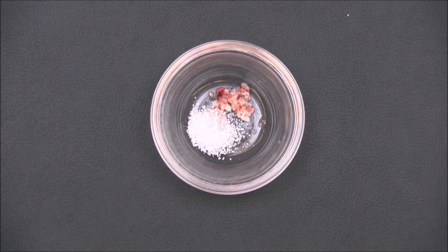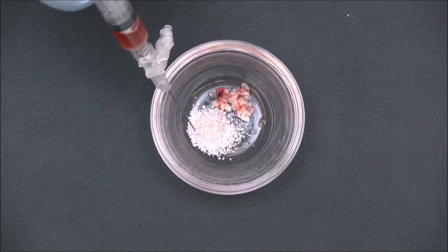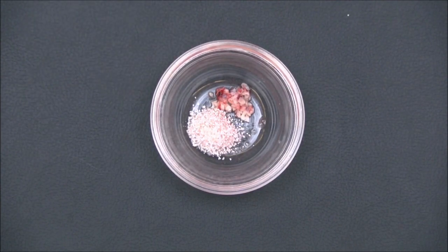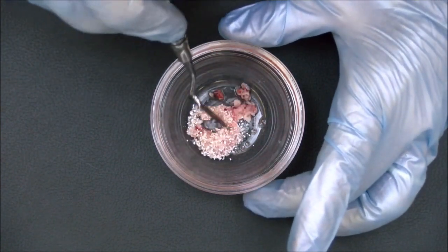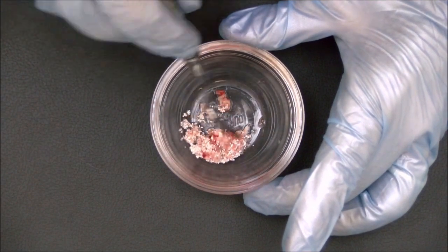To improve its handling characteristics, the bone graft is hydrated with the serum harvested from the bottom of the collection tray. We now mix the PRF into the graft material until it is evenly distributed.